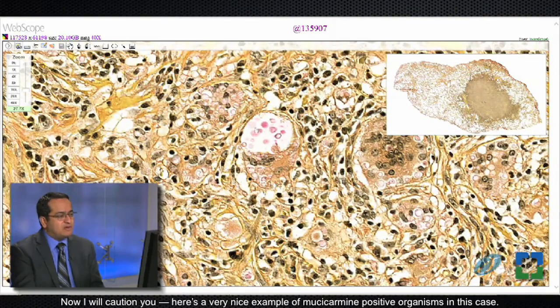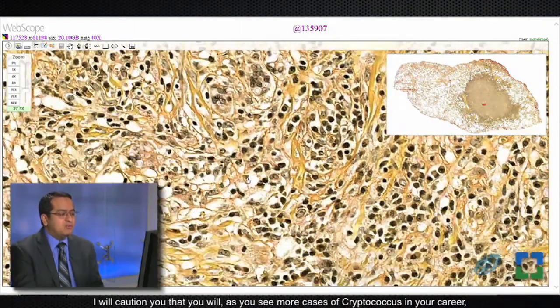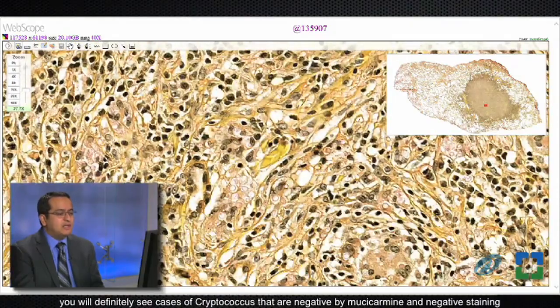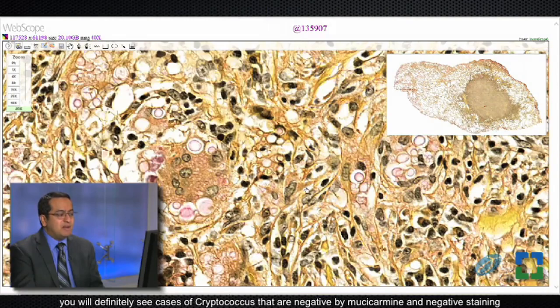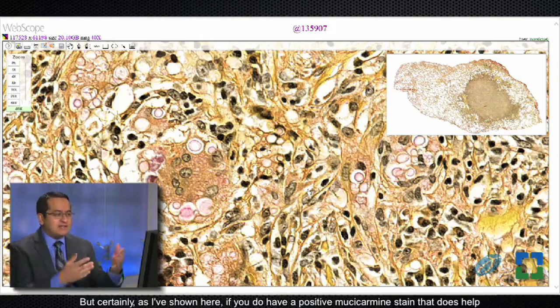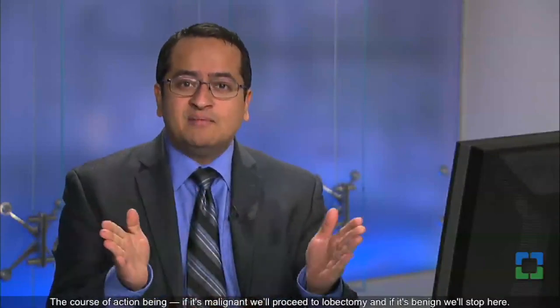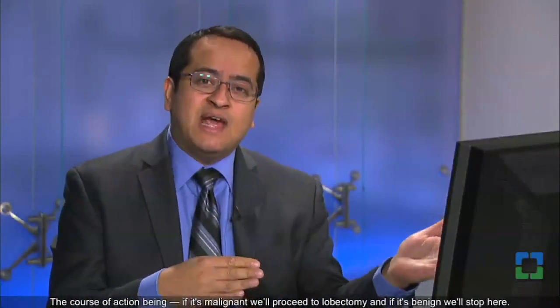Here's a very nice example of mucicarmine-positive organisms in this case. I will caution you that as you see more cases of cryptococcus in your career, you will definitely see cases of cryptococcus that are negative by mucicarmine. Negative staining on mucicarmine does not exclude the diagnosis, but certainly if you do have a positive mucicarmine stain, that does help to confirm it. In this case, the diagnosis was actually made on frozen section — the surgeon's question was simply: is this benign or malignant? The course of action being: if malignant, proceed to lobectomy; if benign, stop here.